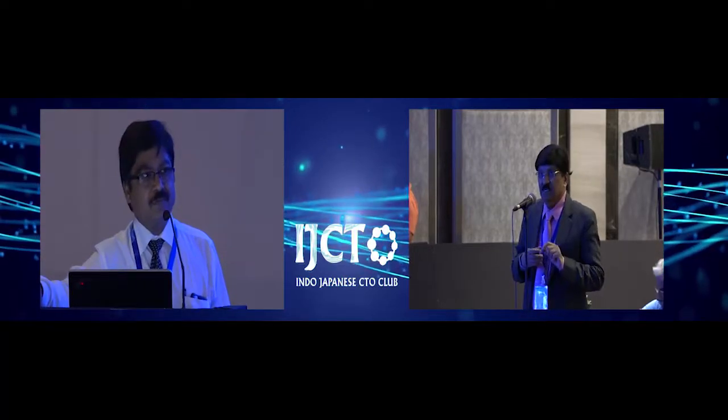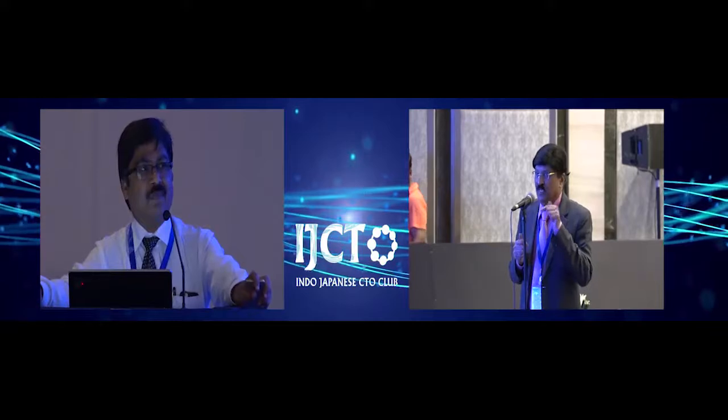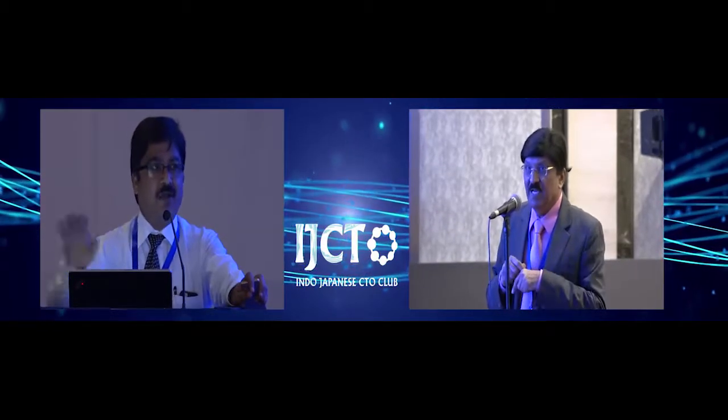Yes. You have to exchange that because your second wire is in the central lumen. So you have to remove that, use the second wire on the monorail, and then use the central lumen. If you want, yes, I will tell you.